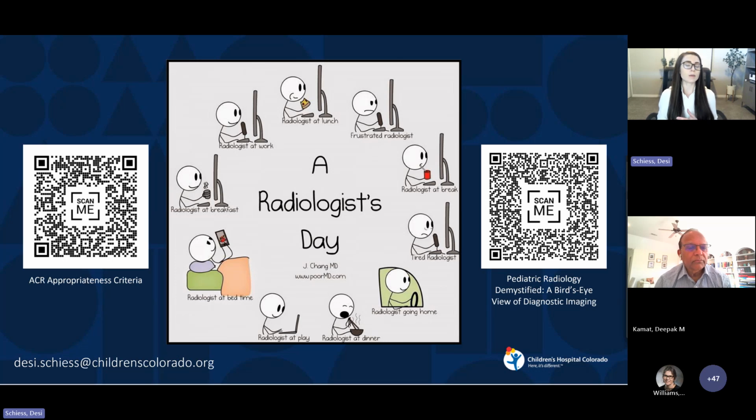And so oftentimes the virtual non-contrast image can be used in place of without and with contrast, especially in children where we're trying to minimize the radiation dose. So to answer your question, I'm not really sure why it's still available as an order. I think it would be used very, very infrequently in children. And so if we do see that order come through, we will oftentimes be reaching out.